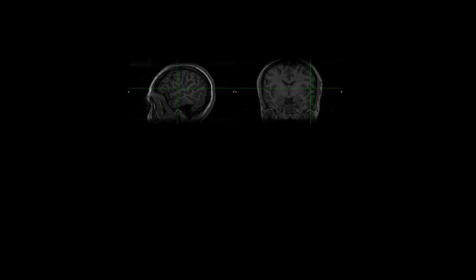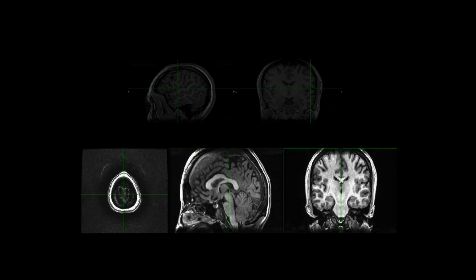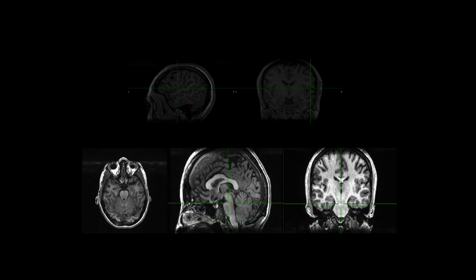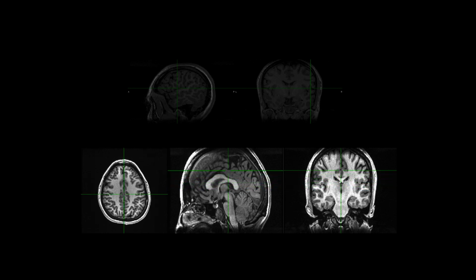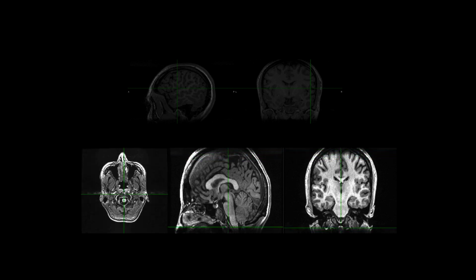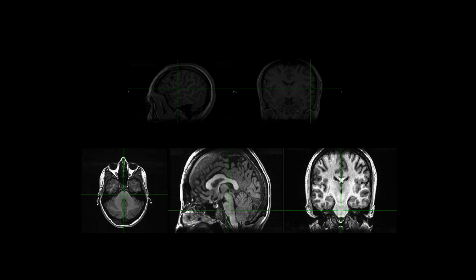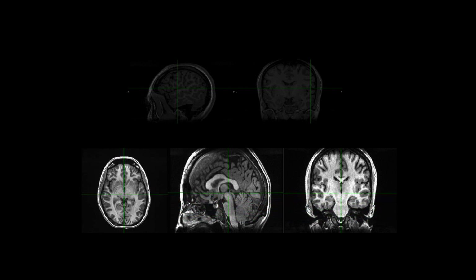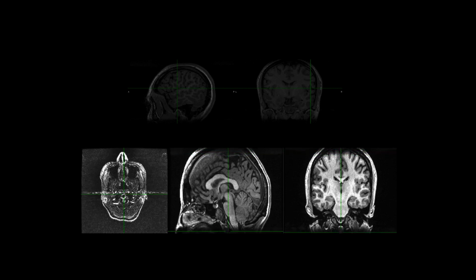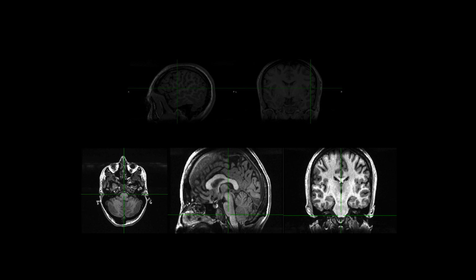Pretty easy to use. If you happen to use something such as the AFNI viewer, on the other hand, they have something called movie mode, where you simply select one of these orthogonal views, press V to enable video mode. You can alter what the frames per second are as well. You can slow it down, speed it up. And as part of my own check, I do this for all three orthogonal views on both the anatomical images and the functional images at a relatively slow clip, maybe a little bit slower than this. But the point is, if something appears that seems to be a little strange, possibly an artifact of either type 1, type 2, or an incidental finding, it should appear pretty clearly on that.